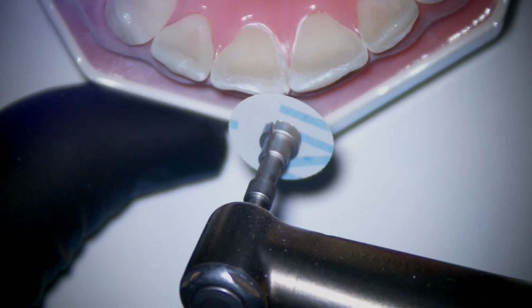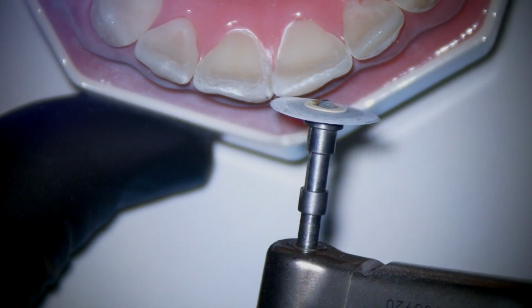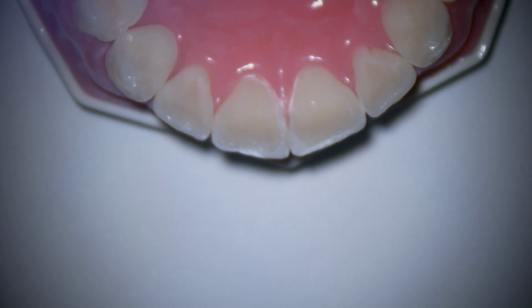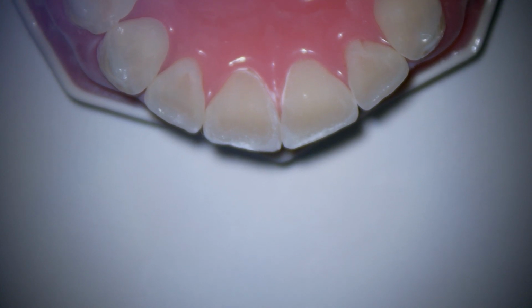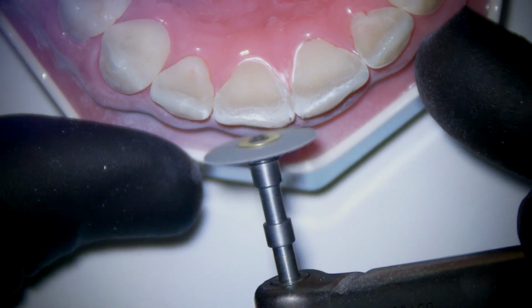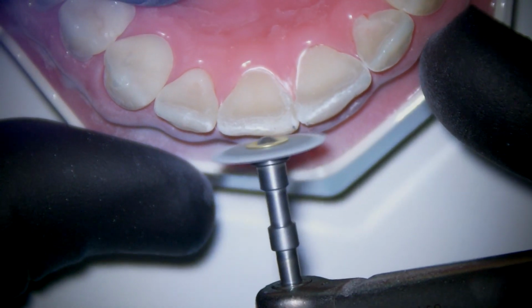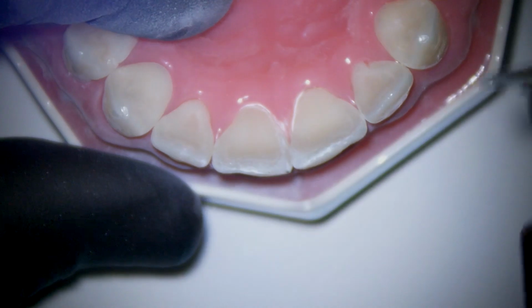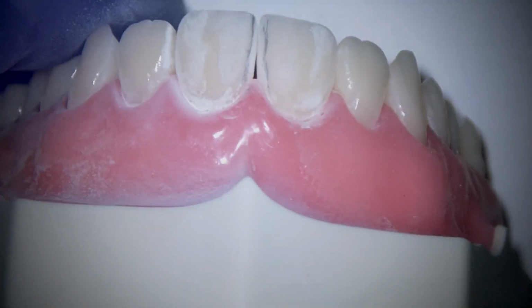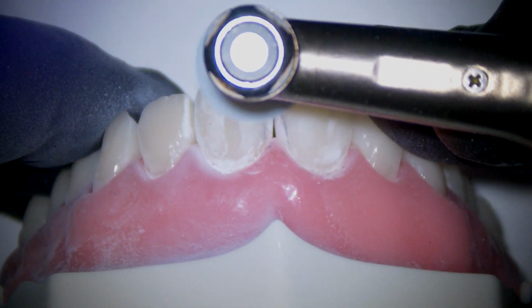If you look from the incisal, you can see I have a little bit of bulk in this zone here on the facial, so I want to use that coarse disc to come and remove some of that bulk to get it to mimic more what I have on the right central incisor. My disc is starting to fill up with grit, so I'm going to switch off. Start with a clean disc. And we'll continue on to get it to mimic the facial surface of the corresponding central.